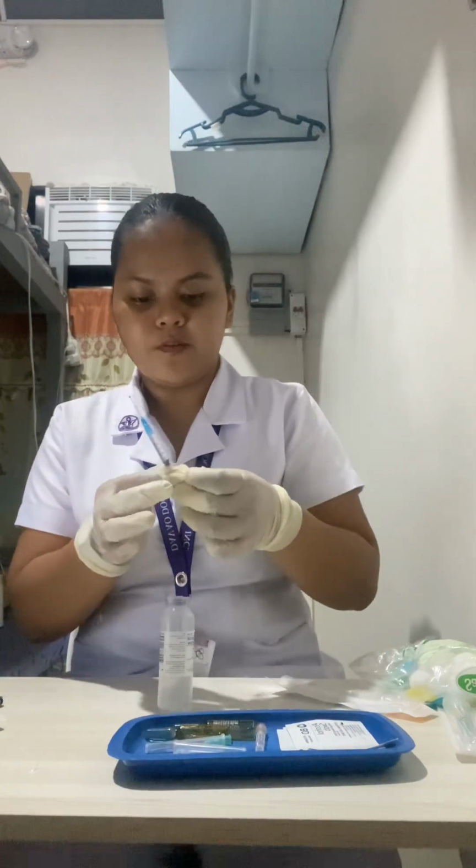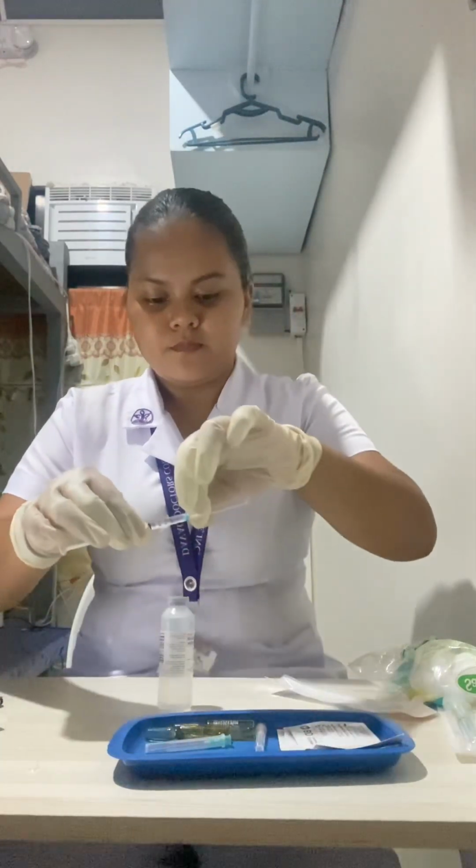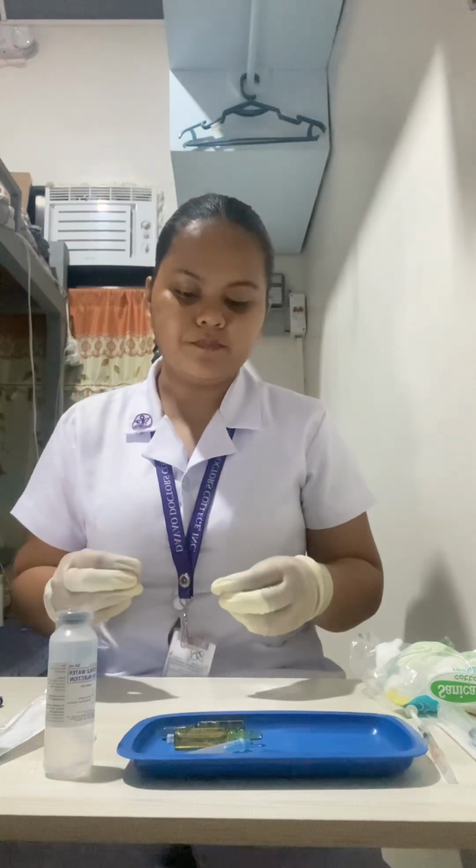Okay, so now I'm going to cover the needle, and that's how you withdraw a medication from a vial. The next thing I'm going to do is to prepare a medication from an ampule. So first thing to do is, of course, perform hand hygiene and observe other appropriate infection prevention.